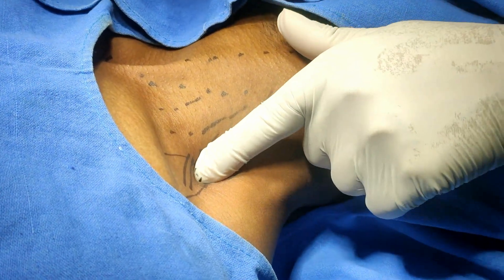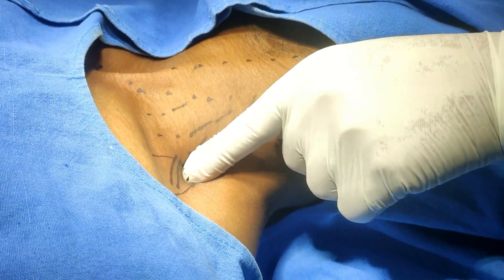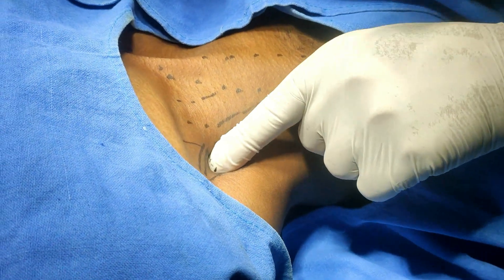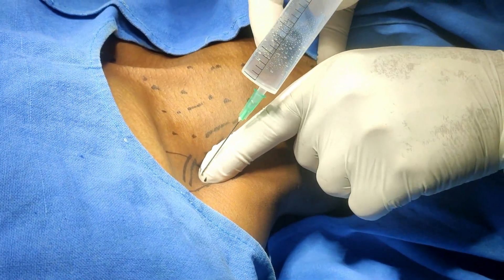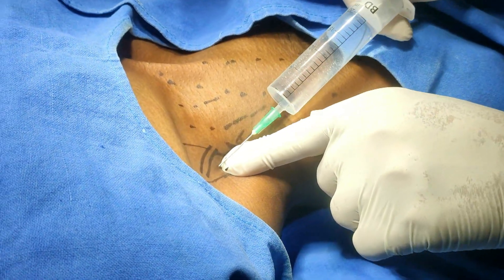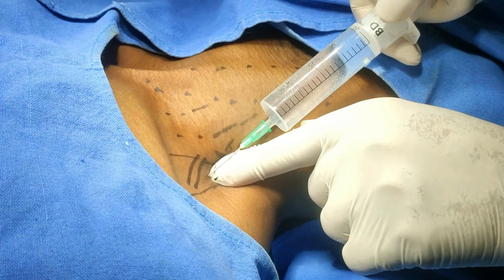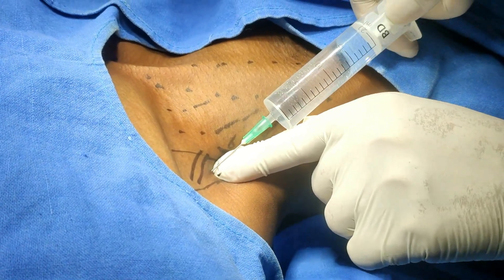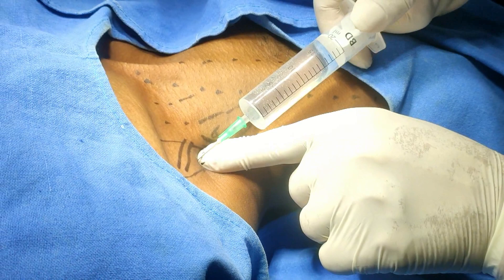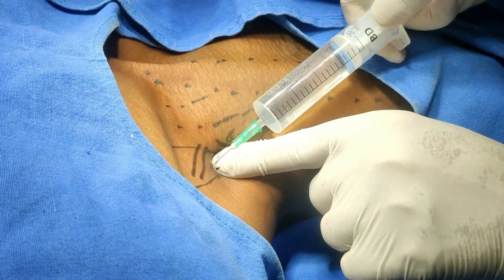Again confirm: the tip of my index finger is in between the scalenus anterior and the scalenus medius. Keep the head a little down and keep watch on the pulse. From here, insert the needle exactly in the interscalene cleft — it should feel a little bit of pulse. Tilt the needle, start injecting the solution, aspirate then inject, advance the needle, aspirate, inject, rotate, aspirate, inject. There should not be any resistance. Your aim is not to elicit paresthesia — don't try to touch the nerve trunks as they give little discomfort to the patient.